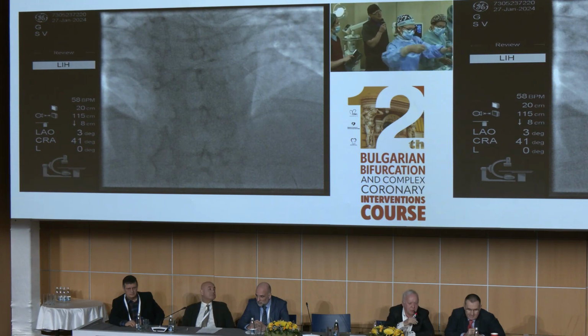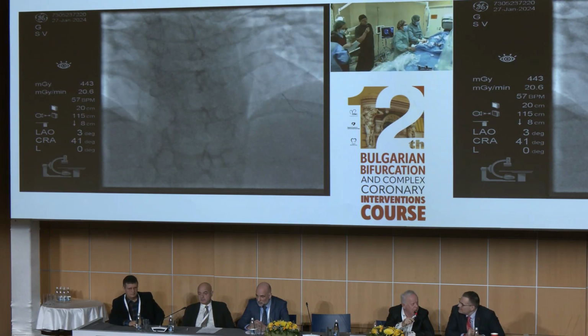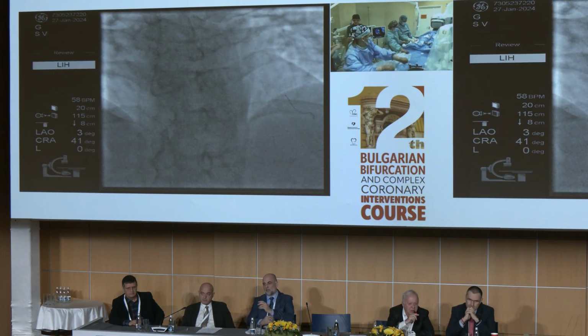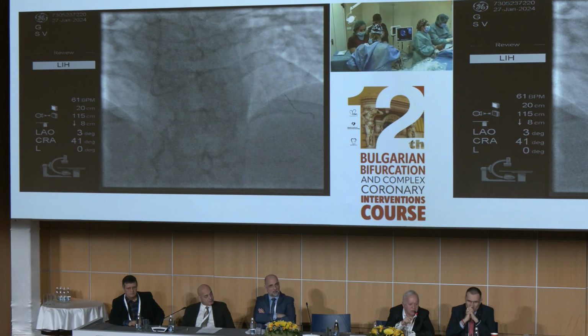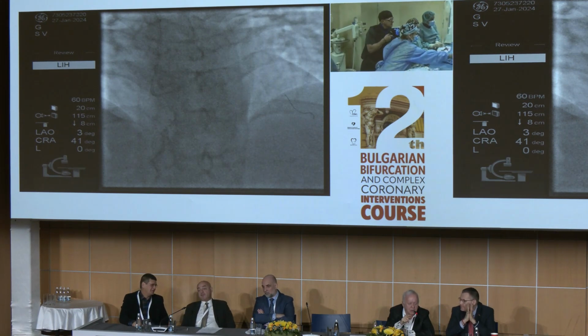Although we probably have enough space, it's probably longer than 6. You will probably have to do it, but anyway, the segment to treat is this one. Valerie, can you look at the nomogram of the balloon? It's not bad.